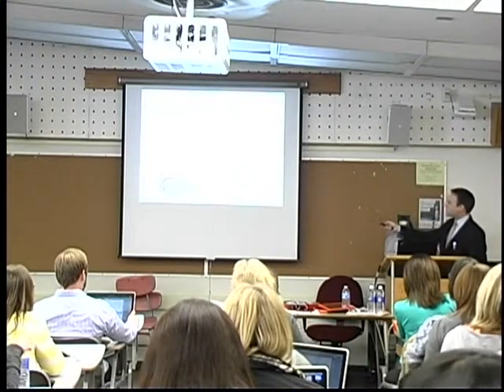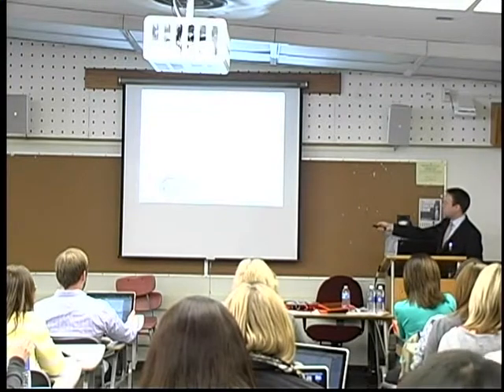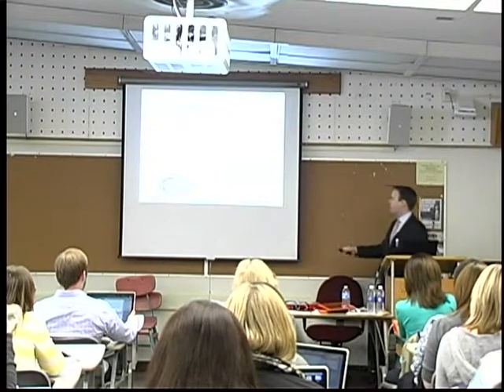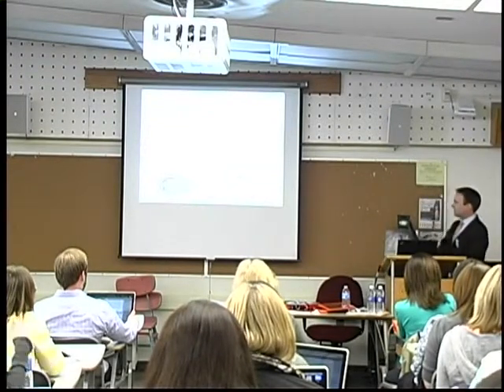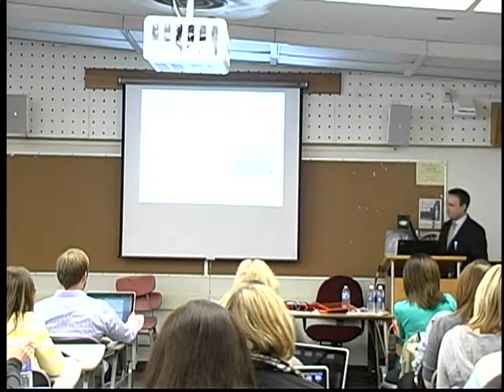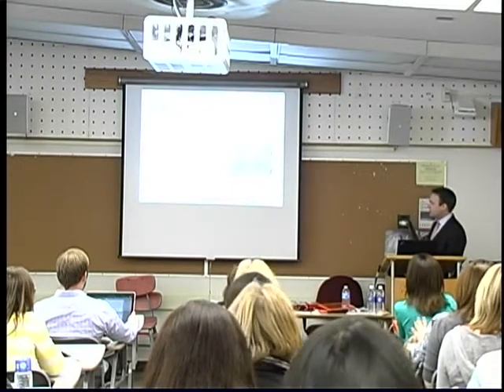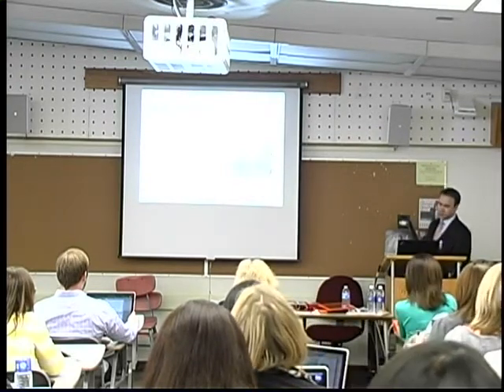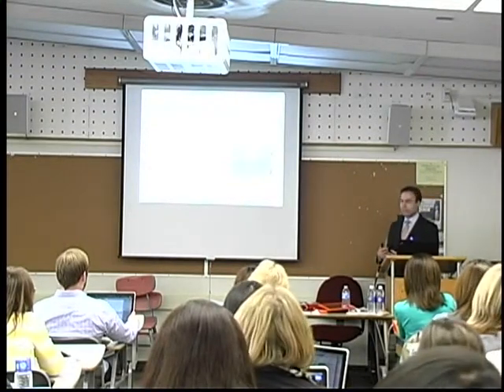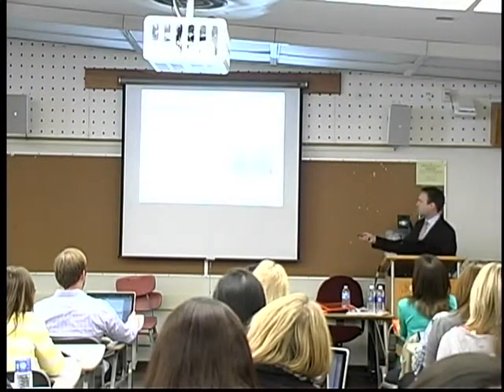With dynamic displays, we can store larger vocabulary sets. The display would change with a new activation. I can go into a new category and have that screen completely reorganized. Very prominent in recent years in the larger AAC community is the idea of having a visual scene display. What that means is that language concepts are embedded into larger contextual scenes and ideas. Objects and events within the photograph are then used as symbols for communication.